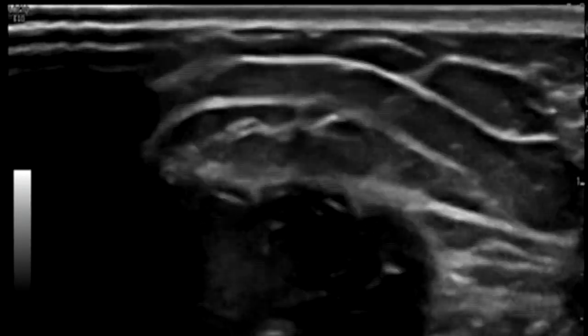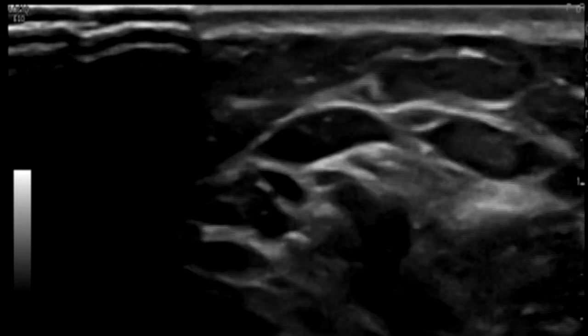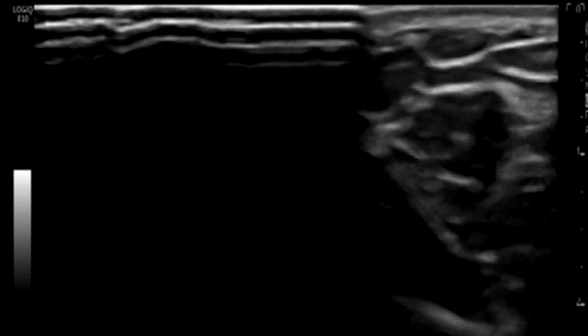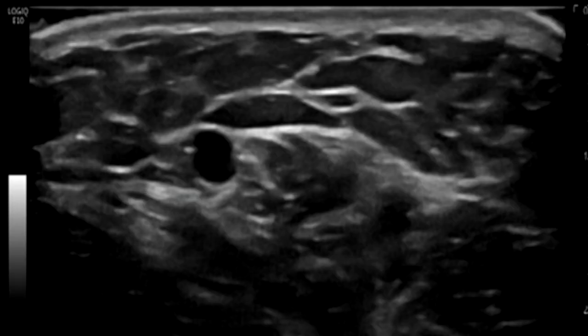Follow the vein proximally. The cephalic vein may drain into the axillary vein, or go further and drain into the subclavian vein, where it is known to pierce the clavipectoral fascia before entering the subclavian venous circulation. Trace it cranially as far as possible — sometimes you may not be able to visualize it draining into the subclavian. This completes the proper evaluation of the cephalic vein as well as the distal arteries.